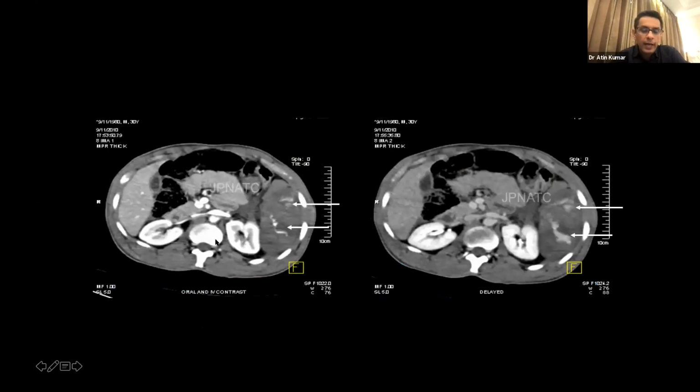I'm showing you one arterial phase of the CT scan. In this, you see hyperdense linear irregular areas which do not look like normal vessels, but they are the contrast which we give in the vessels. So this means this is contrast outside the confines of the vascular wall. This is active contrast leak.